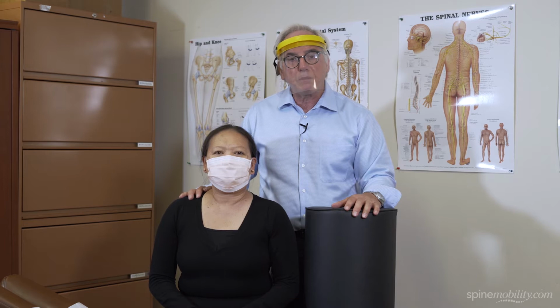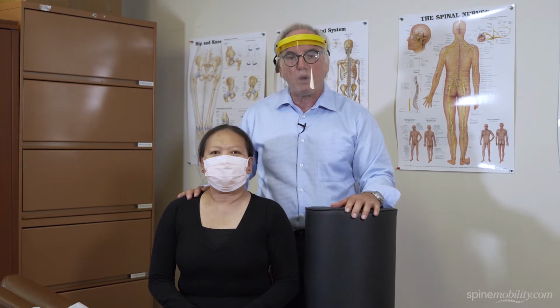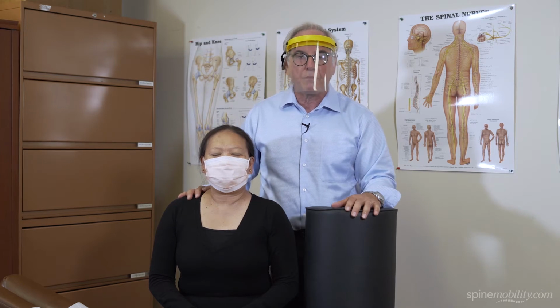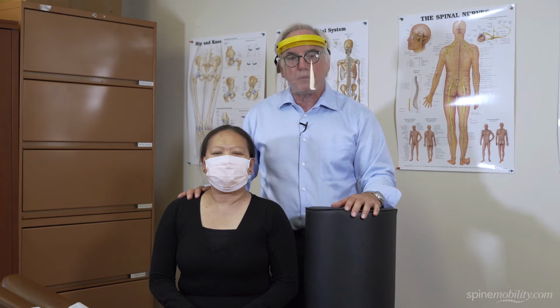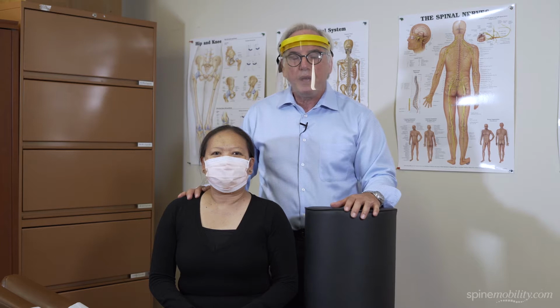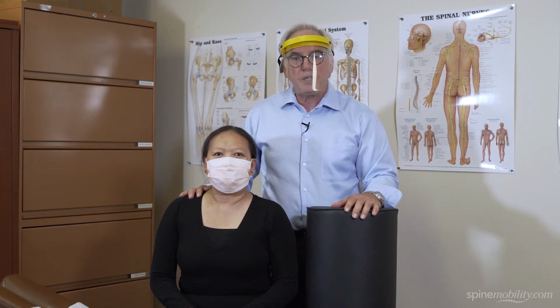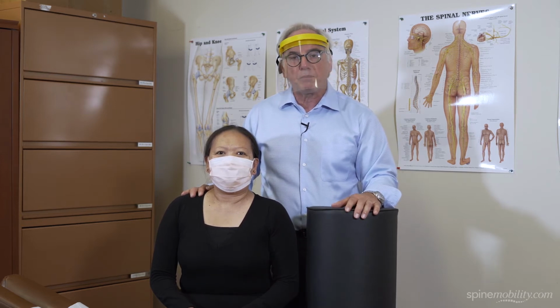One, for practitioners to help them implement the treatment protocol and the therapy techniques of the stenosis protocol, as well as the persistent low back pain protocol. Second, for clients and patients to assist them in performing some of the specific exercises in these bootcamp programs. And finally, for patients and clients to help them reduce symptoms of back pain and leg pain when sitting and/or lying down.